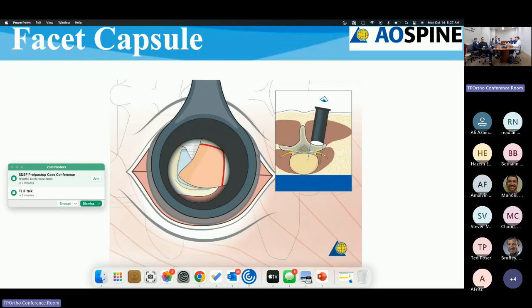Okay, first step, you can do it a number of different ways. I basically like to do just a laminotomy, and then I take the laminotomy to the end of the flavum rostrally. When you start getting a little bit north, you'll start to see some epidural fat, and you're at the level of where the flavum is going to end. When you get that north, and if you just start coming laterally to the pars, which is usually what you're trying to avoid, injuring the pars, but if you just come through the pars laterally, kind of make like an L cut almost, and you can do it with Kerrisons or the drill, then you can just get the IAP off, which is the most important first step to the procedure.